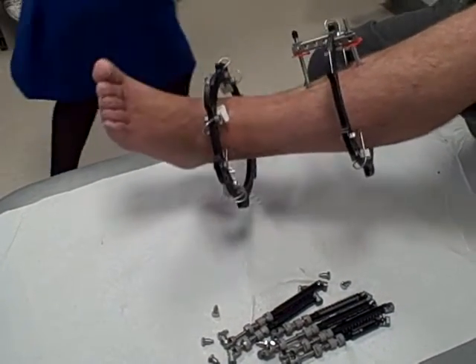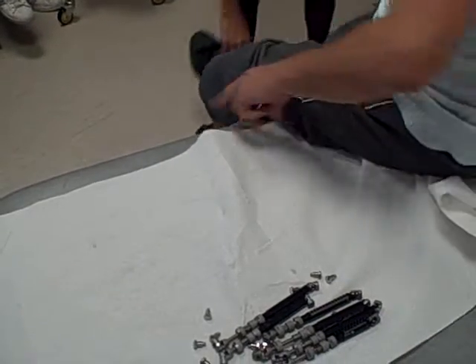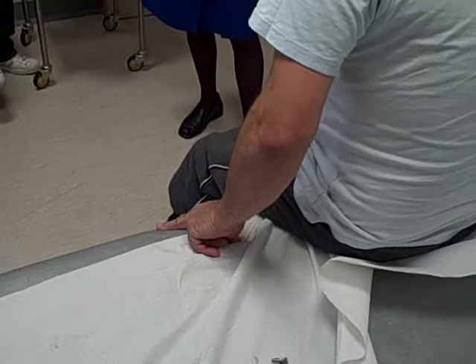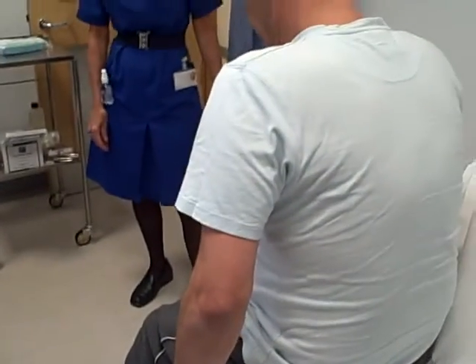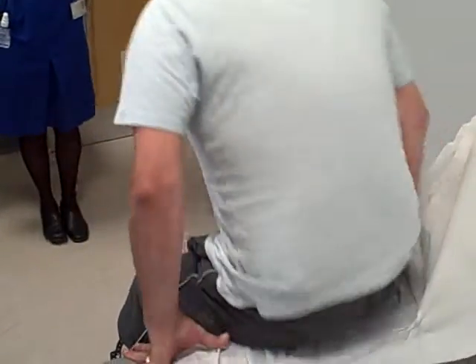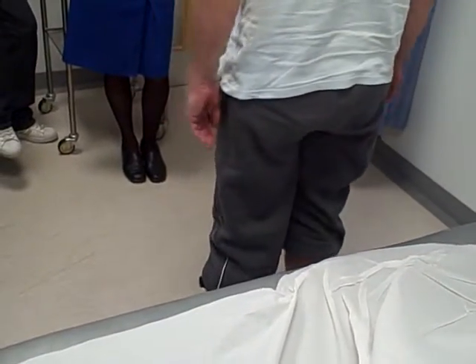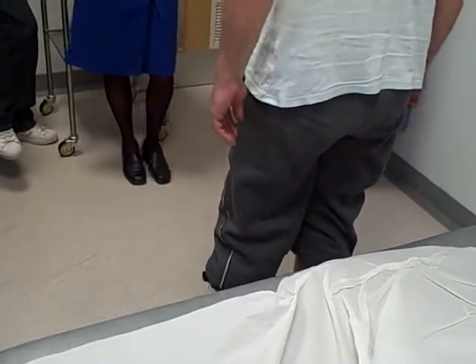This is completely taking the strain through the fracture site now. You'll be able to feel it. And if there's any doubt, you can feel anything going through the fracture site. Do you want to use your crutches to start with, or are you happy to stand up first? Feels fine. Would you like your crutches? No, no. Sure, just steadily take a little walk.